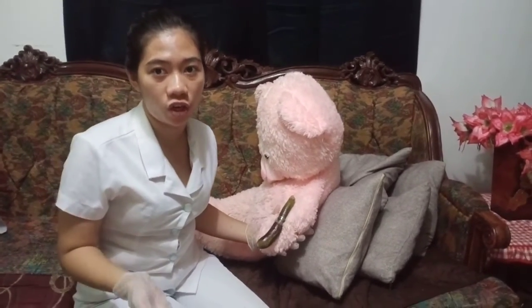Then, transfer and hold the swab between the third and fourth fingers of the non-dominant hand, in readiness for the needle withdrawal. Then prepare the syringe for the injection.